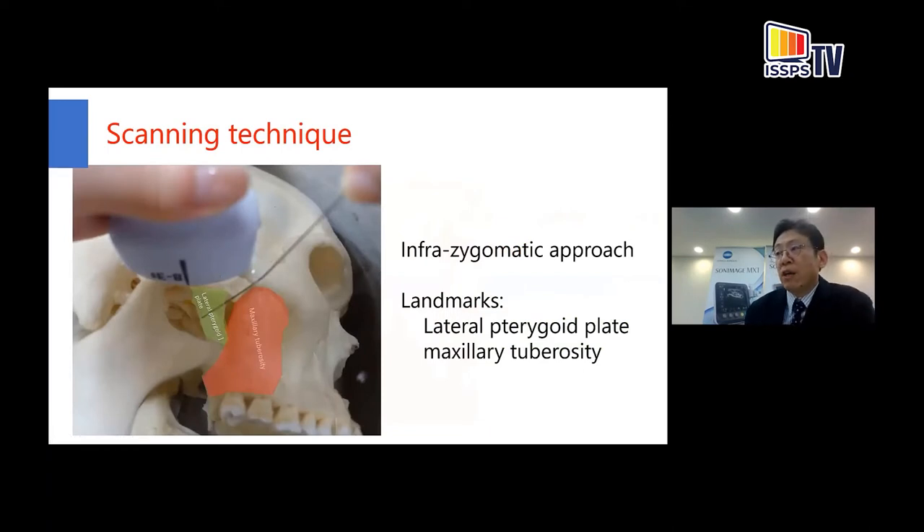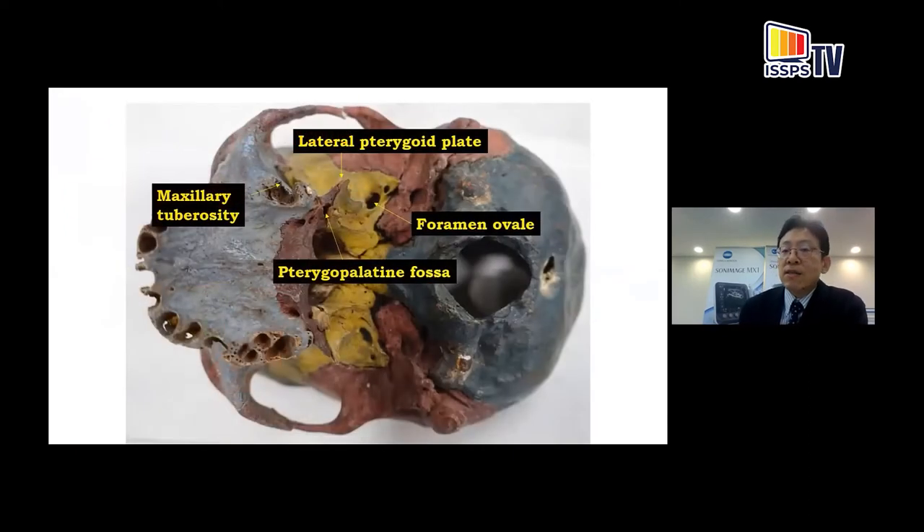Next, I move on to the scanning technique for the infrazygomatic approach of maxillary and mandibular nerve blocks. The important landmarks are the lateral pterygoid plate and maxillary tuberosity. The gap between these two structures is the pterygopalatine fossa where the maxillary nerve is located. The foramen ovale is located just posterior to the lateral pterygoid plate, so we can aim a needle to the maxillary and mandibular nerve using these two structures.